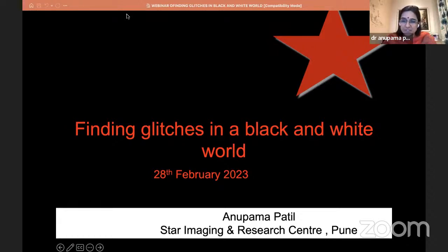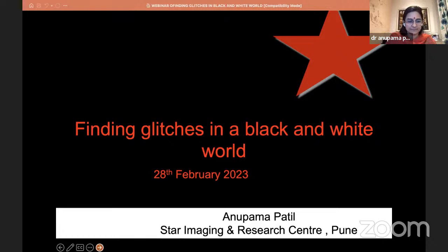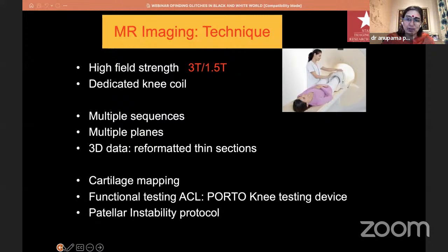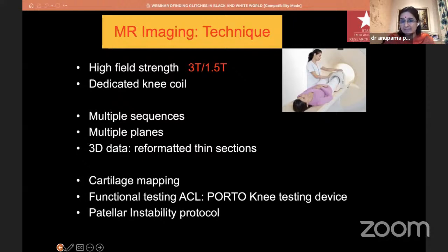Good evening everybody. If Sachin thinks 10 minutes is less for physical examination, it's really less for radiology, but I'll try to include whatever I can. The technique is what is important for any kind of good MR imaging. Once you have good images, anyone with even average knowledge of anatomy should be able to understand MRI images fairly accurately. The images shown here are all acquired on a 3 Tesla unit with a dedicated knee coil. We take images in multiple planes — axial, coronal, and sagittal — and also acquire a 3D dataset which we reconstruct as required, adding patellar instability protocol, cartilage imaging, and functional testing as needed.